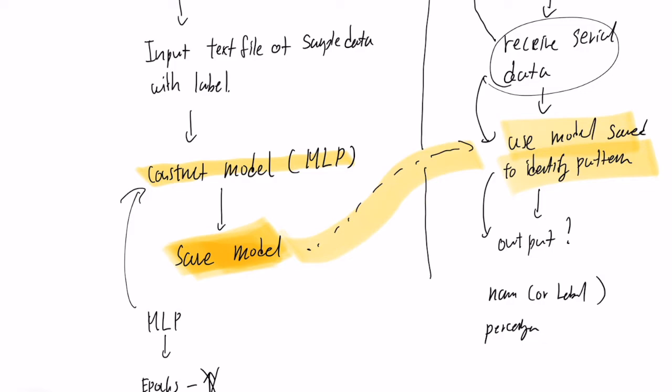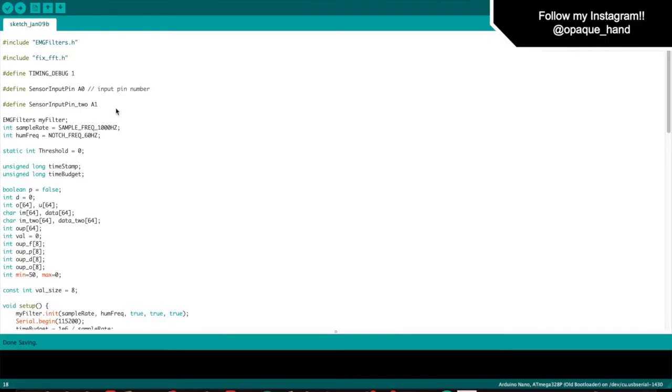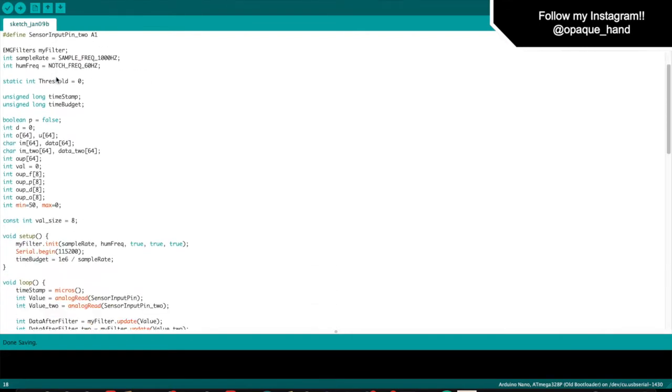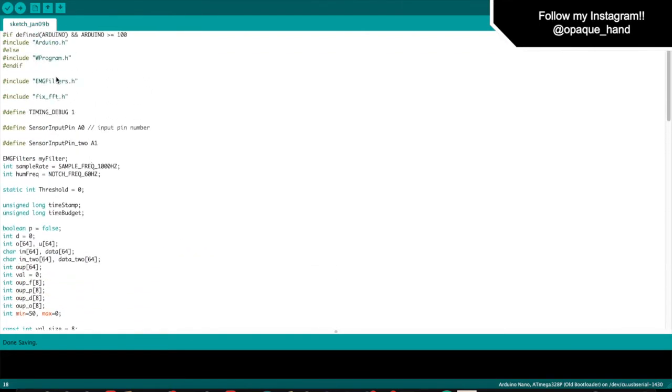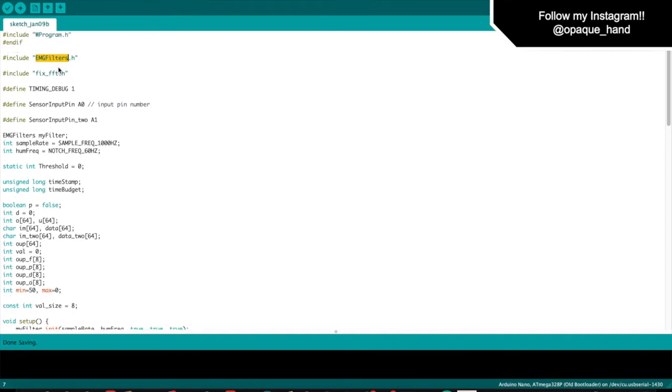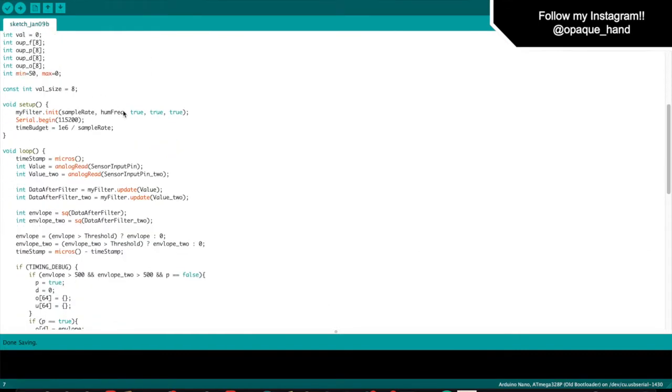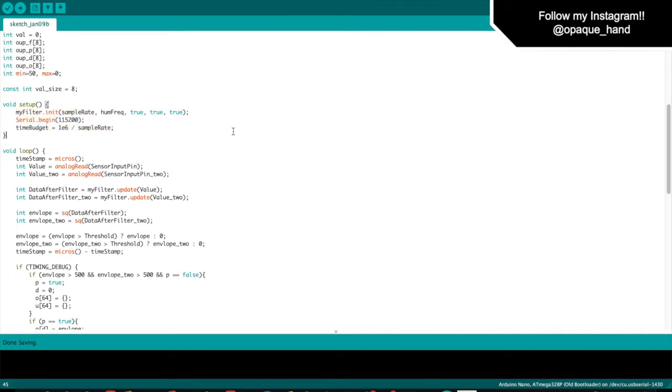So now, let's program it. I'll be going over the Arduino code briefly. We're going to use Fast Fourier Transform and EMGFilter, which is a sensor. So here, we initialize the serial and initialize the filter for the sensors.